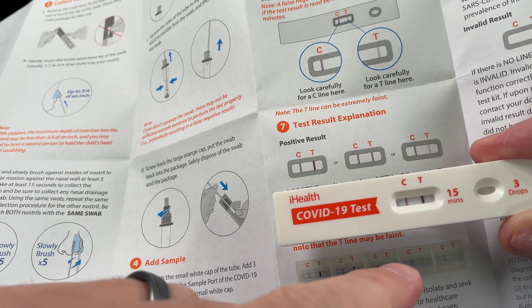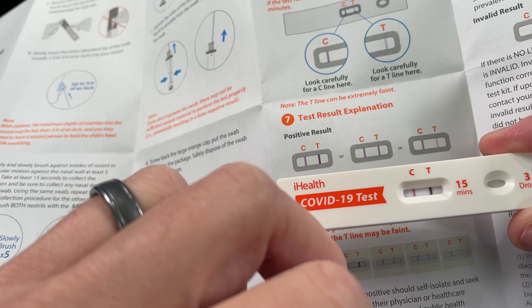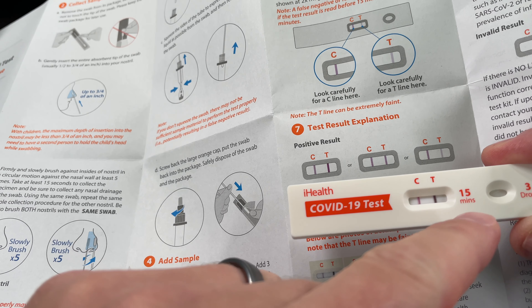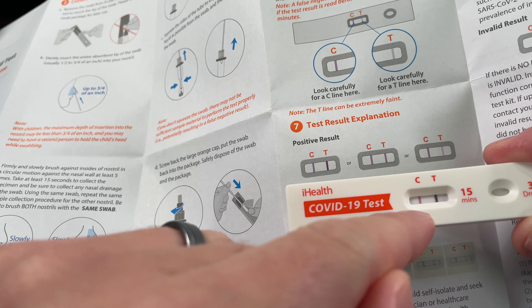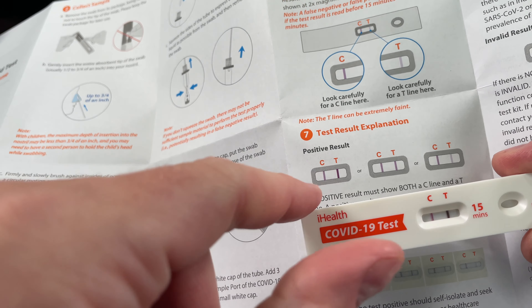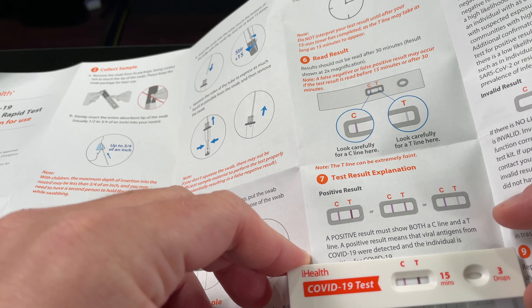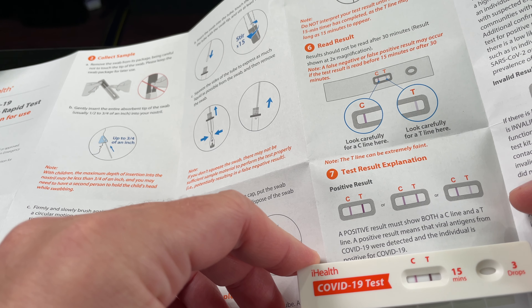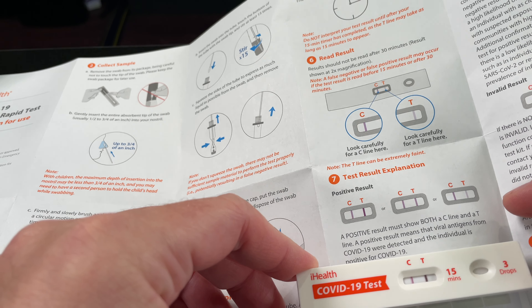Actually, within seconds of putting those three drops on there, I noticed both of these lines emerge. You can see here that, according to this diagram and this test, I am COVID positive. It says a positive result must show both a C and T line. A positive result means that viral antigens from COVID-19 were detected and the individual is positive for COVID-19.